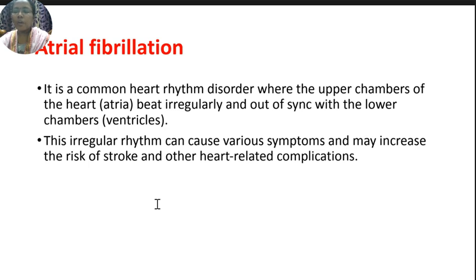Okay, and now we are going to discuss the specific disorders related to each category. For the P wave category, the missing P wave. The missing of the P wave is called atrial fibrillation. If we miss the P wave or any improper contraction, that may lead to the fibrillation effect.